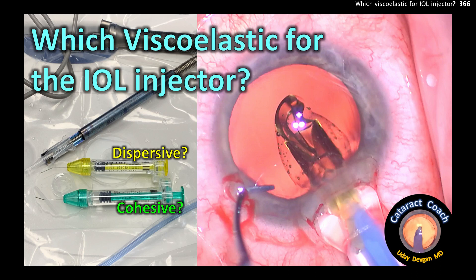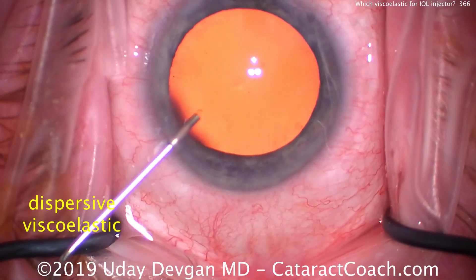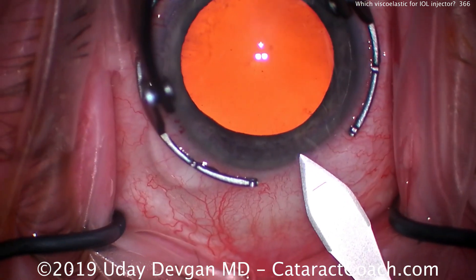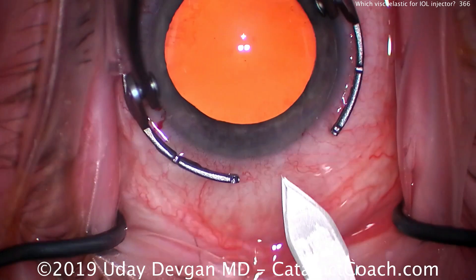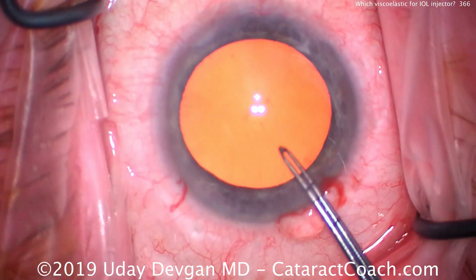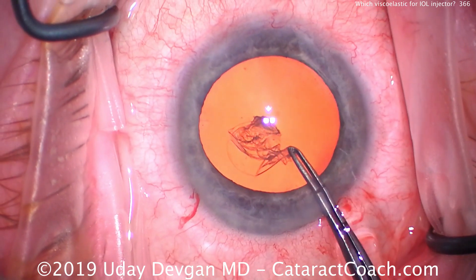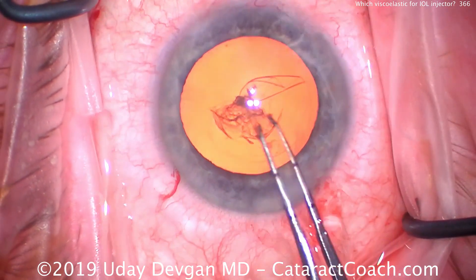From cataractcoach.com: which viscoelastic should you use for the IOL injector — a dispersive or a cohesive? At the beginning of the case we use a dispersive viscoelastic to protect the corneal endothelium. This agent is thinner and tends to adhere better, staying in place during phaco. We'll make our main incision here. It keeps the anterior chamber inflated during capsulorrhexis creation. A dispersive viscoelastic is perfectly sufficient for most surgeons. Think of a dispersive as a thinner agent — like honey or molasses, more liquid than solid, and it coats things very well.